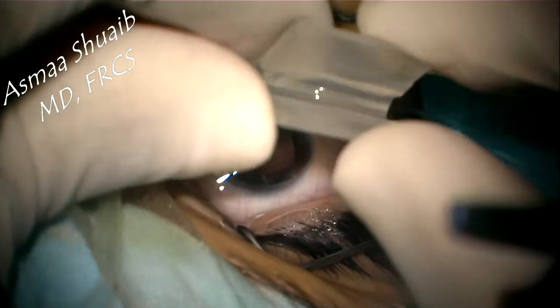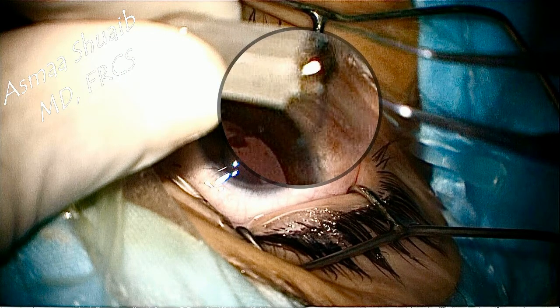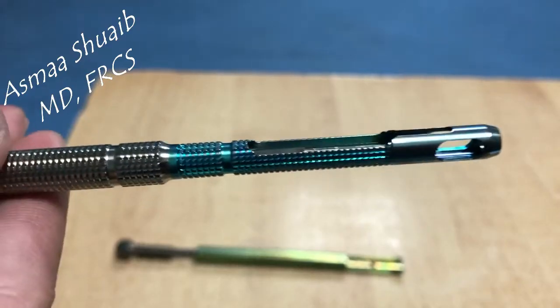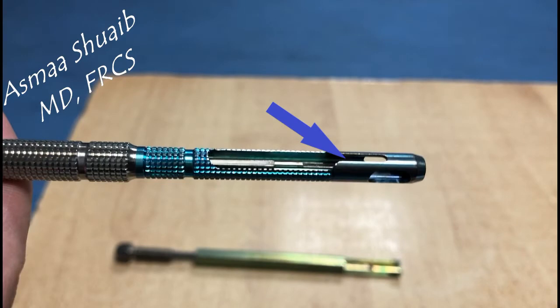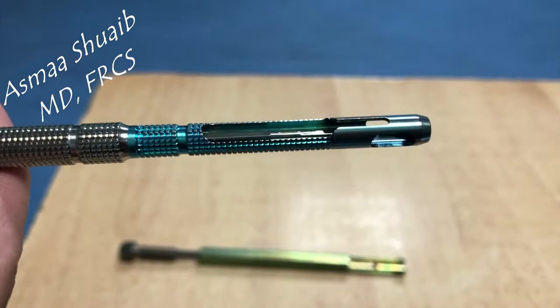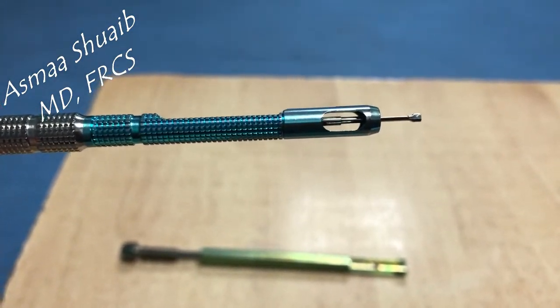Close the leaflets of the cartridge and keep the trailing haptic hanging outside of it. This cartridge is compatible with this type of injector. The closed leaflets of the cartridge are pushed into the groove until a click is heard, and then the IOL is pushed by the plunger.